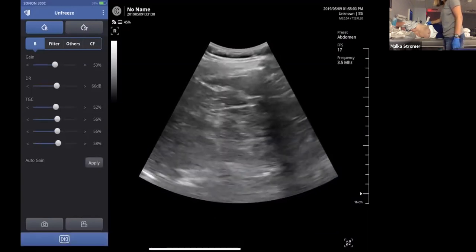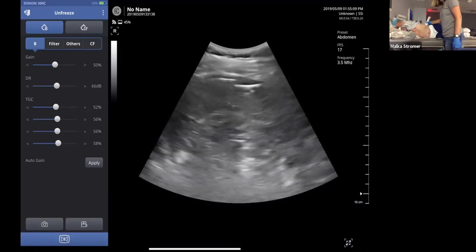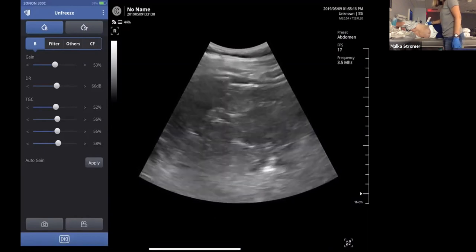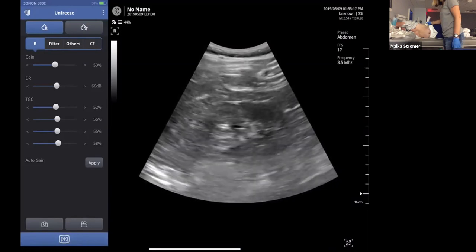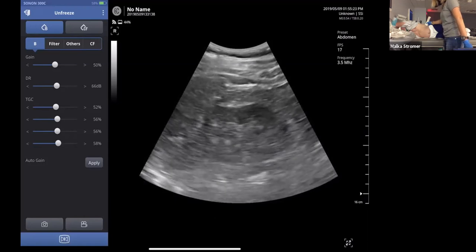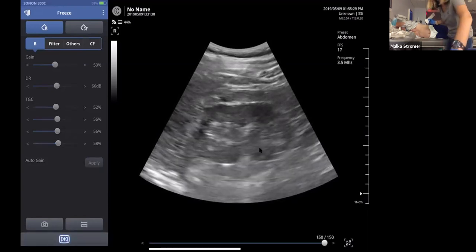Okay, and so again, as we see on the right side, take a breath in, small breath in, hold it there. Okay, so this is really nice. We see a long length of the left kidney. Okay, we're scanning through that. You can see the cortex as hypoechoic. I'm just going to freeze it right here. Good, relax. Okay, so the hypoechoic cortex, hypo to isoechoic to the spleen right here, and this is the echogenic center. Okay, you can also see some little anechogenicities. Those are the pyramids.